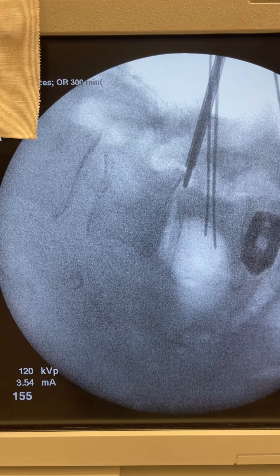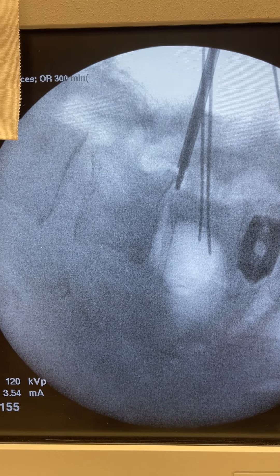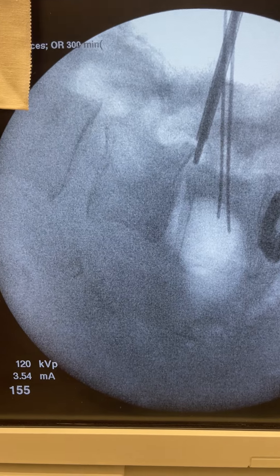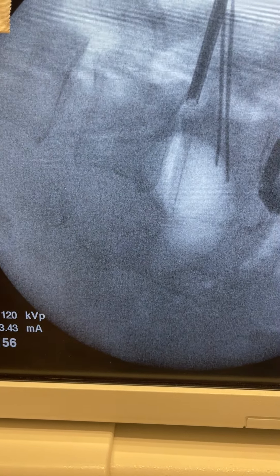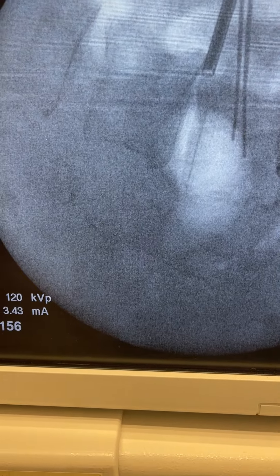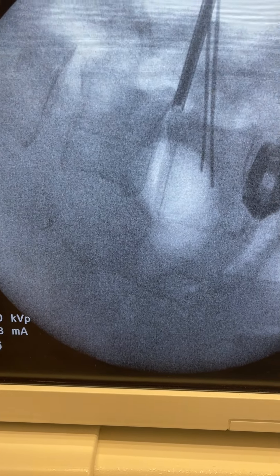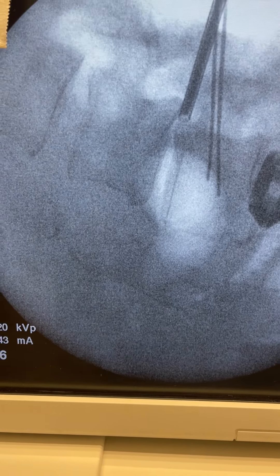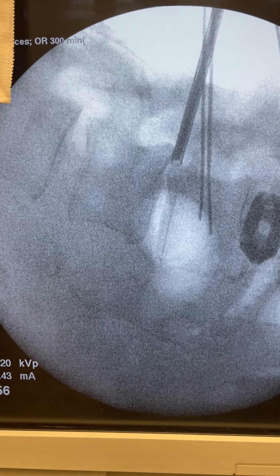You see the disc is extremely collapsed and we have a quite significant spondylolisthesis, and here we have difficulty to get the K-wire in.